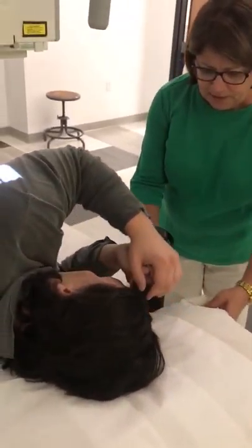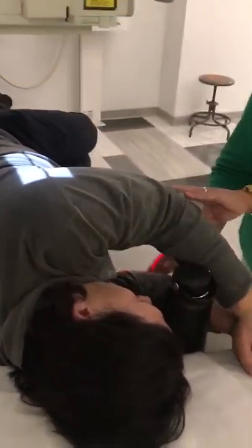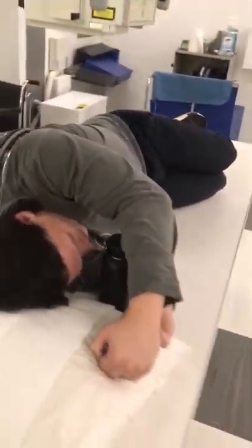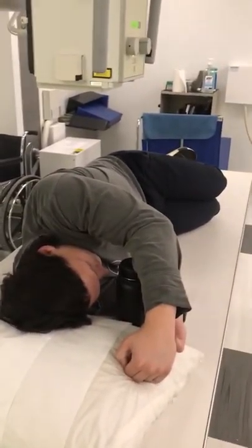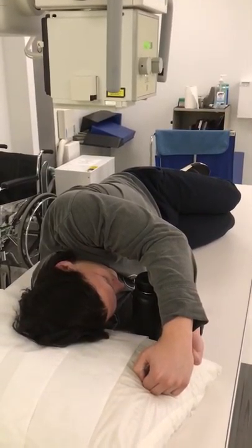I'm gonna give you that cup again, I'm gonna give you those instructions. You need to keep those arms up high. Okay, big gulp, sir. Start drinking. Keep drinking. Exposure. You may stop drinking.